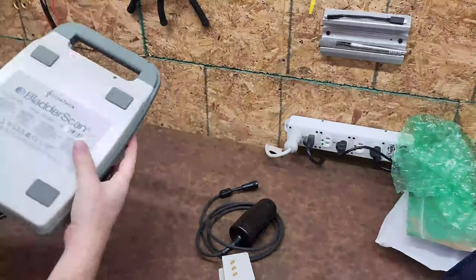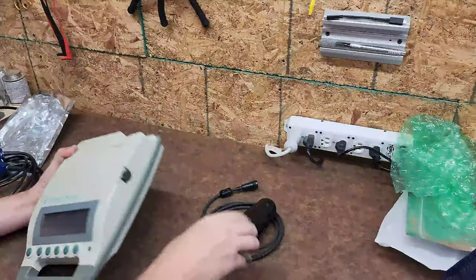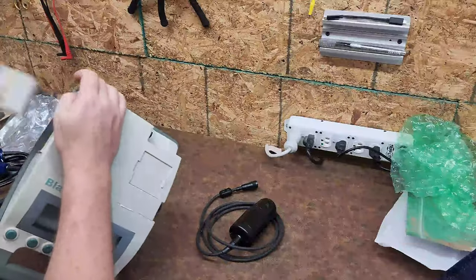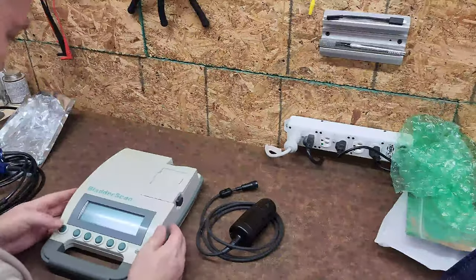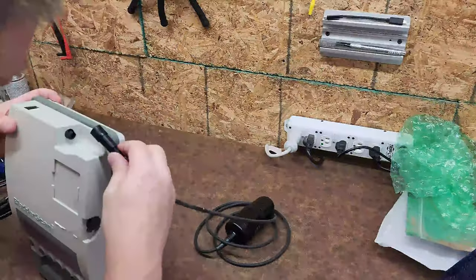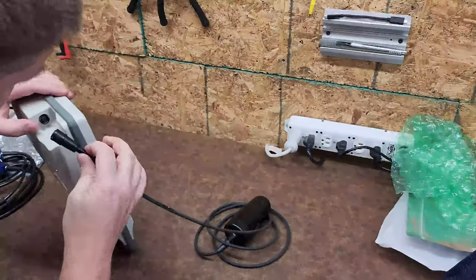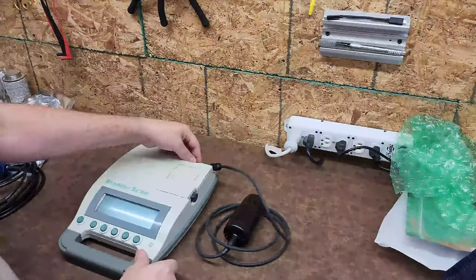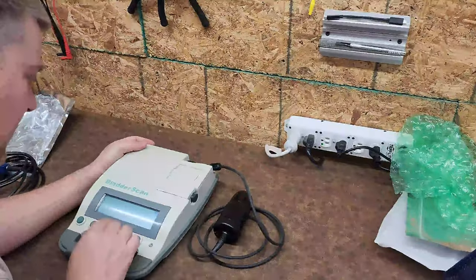So I have the Verathon bladder scanner. Let's try and see if it boots up. I'm doubting myself... okay, we got some power! I do believe that this port is keyed — yes it is — and I have to be very delicate because that port is cracked.